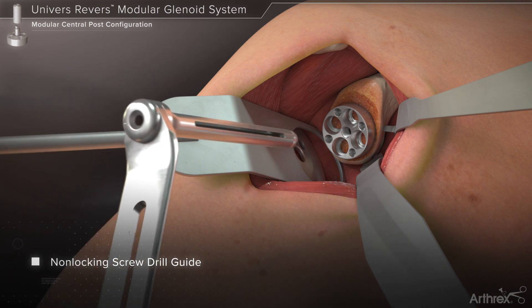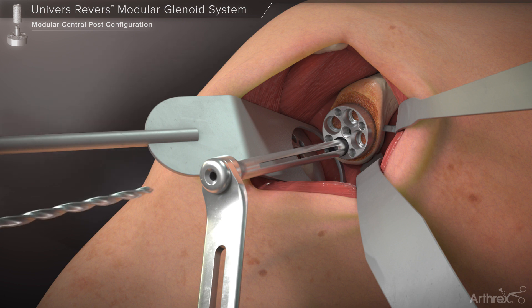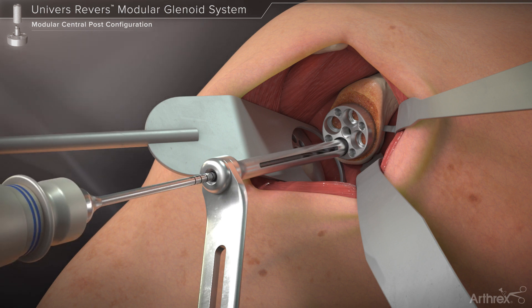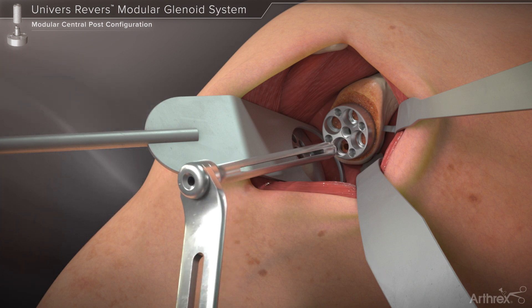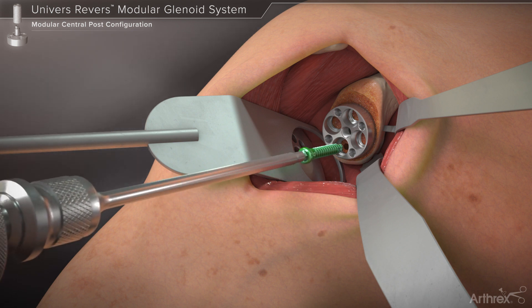For non-locking screw preparation, the variable angle non-locking drill guide is inserted into a peripheral screw hole and directed toward the desired screw trajectory. The 3 mm drill bit is then used to create the hole for any peripheral screws. The number on the drill bit shaft should be noted as they indicate the length of the peripheral screw to be used. The drill guide is removed from the base plate and the screw is inserted using the hex driver until it is fully seated within the base plate.